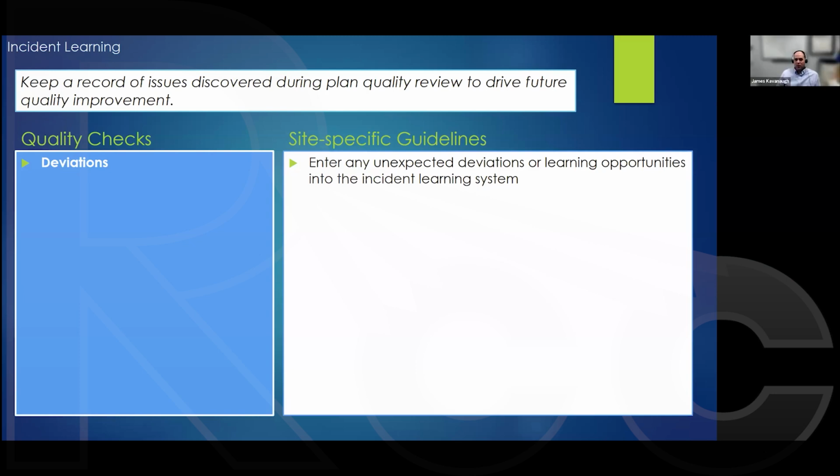I will say that our physicians tend not to use gradient index metrics. They tend to look at isodose distributions. The challenge with that is it requires experience. You have to see a bunch of these plans to know what is reasonable, versus a number that we could give you and say, hey, this is the number, and then you could use that as a metric.